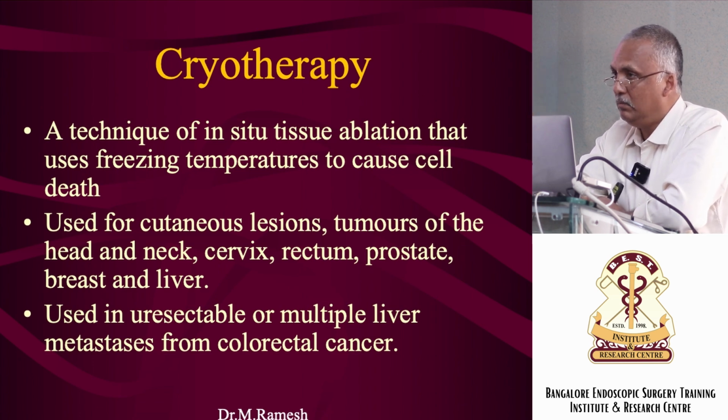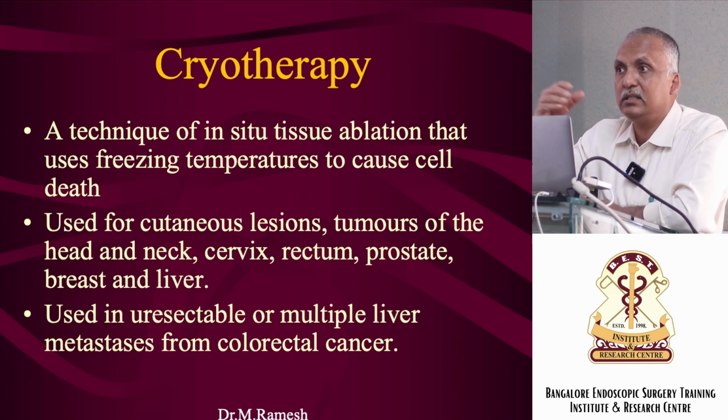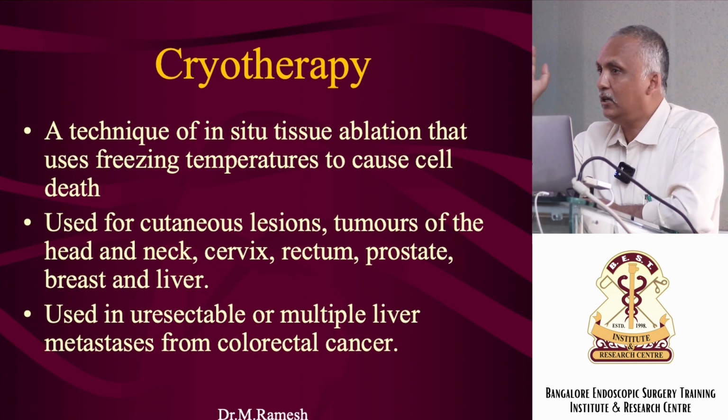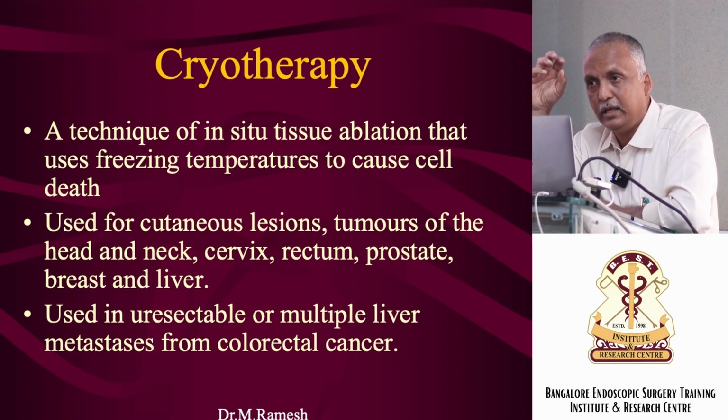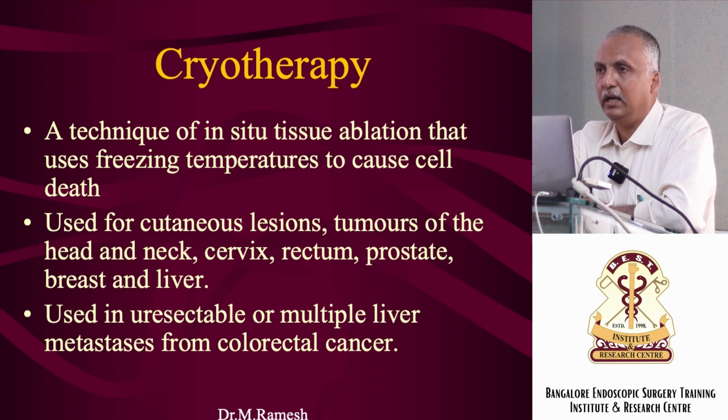But in cryosurgery, the disadvantage is you cannot see to what extent. In argon beam, you could see which is dead and which is alive. Here you cannot see. So you go by the rule of thumb. You say in chronic cervicitis, I want 2 to 3 millimeters of coagulation or 5 millimeters, whatever it is. That will happen when I hold this cryo for 5 minutes. So you go by the clock, you don't go by your looks.